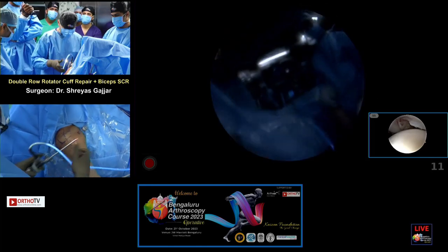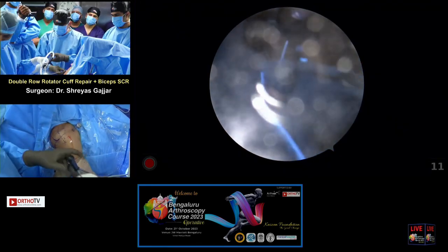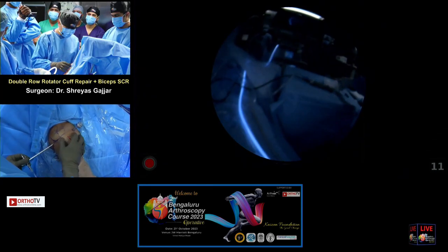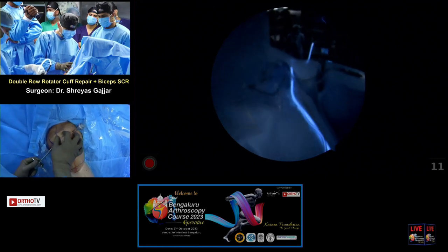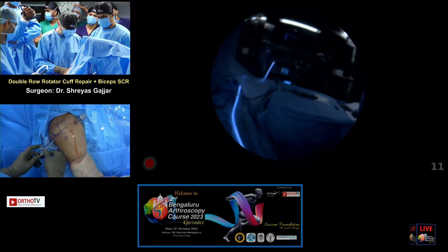Do you do anything to mark the point so that if it's full thickness, I don't. If it is partial, then yes, I use a 16 gauge Venflon to just mark that area. So now I'm in the subacromial space.